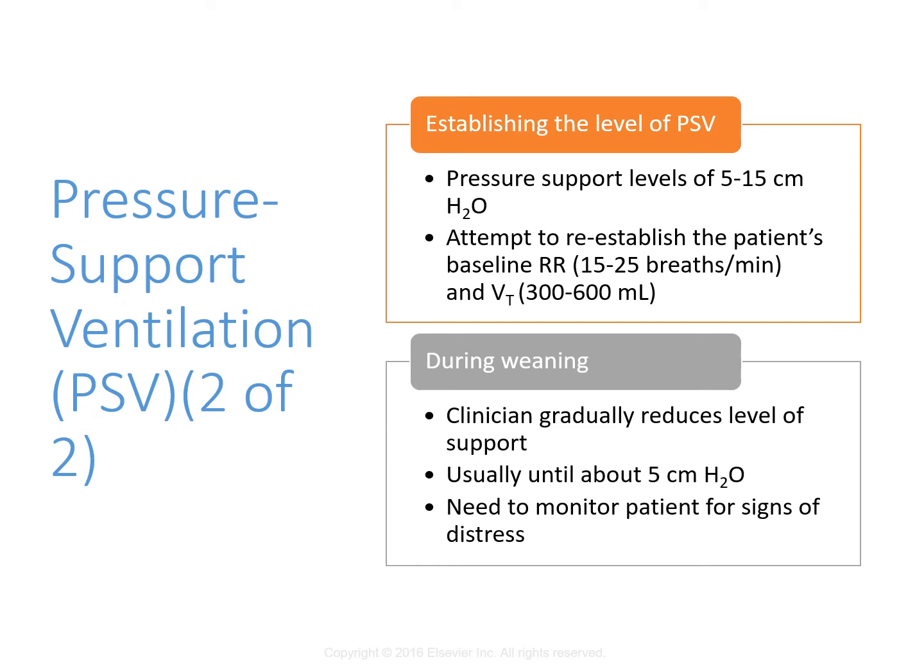So the resistance, airway resistance of the ET tube, the trigger sensitivity, right? They have to pull just to trigger a demand, the flow demand capabilities, the type of humidifier you use could even play a factor. What if there's an air leak in the ventilator circuit around the cuff or a chest tube? That could all interfere with pressure support breath termination too. So things you have to look at here as well.